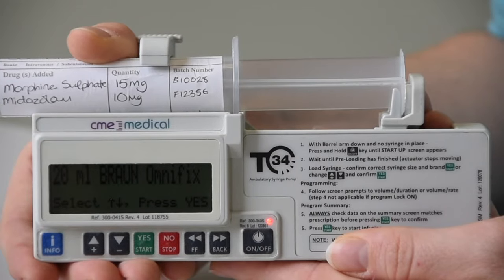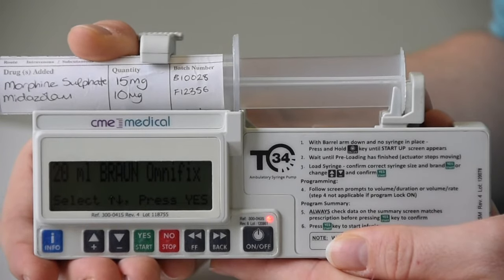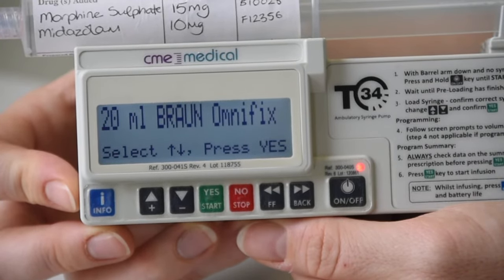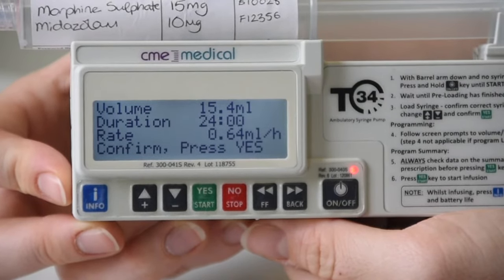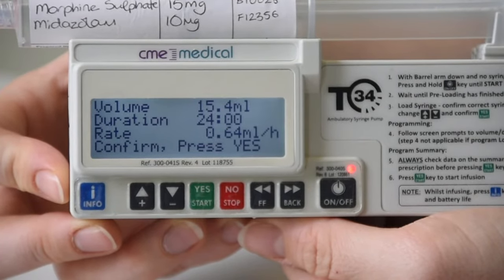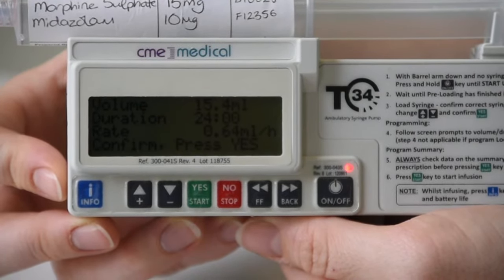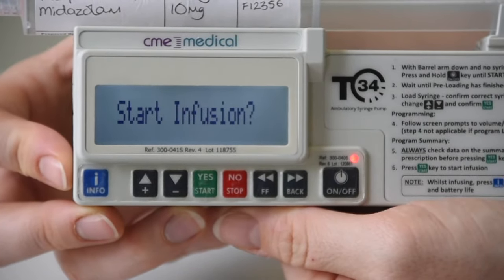Once in place, on the screen, it will tell you the brand of syringe, 20ml Braun Omnifix. These are preset within the hospital. You are asked to confirm this by pressing the Yes button. The screen will then display the starting volume, duration of infusion, and rate of infusion. Once you have written these down, press Yes. The screen will then ask Start Infusion.